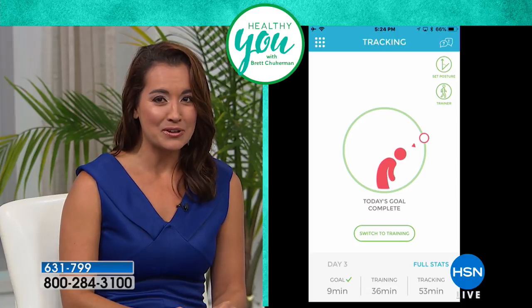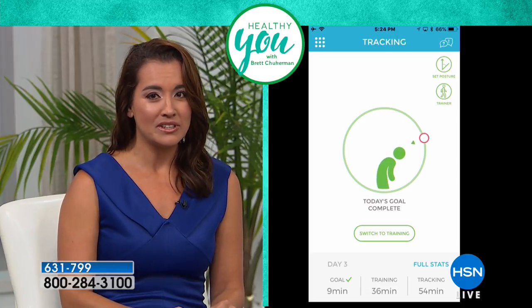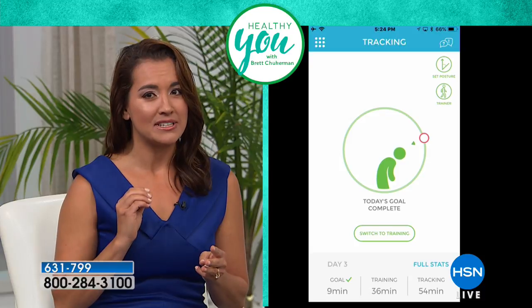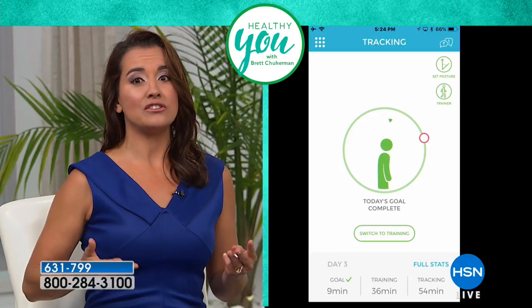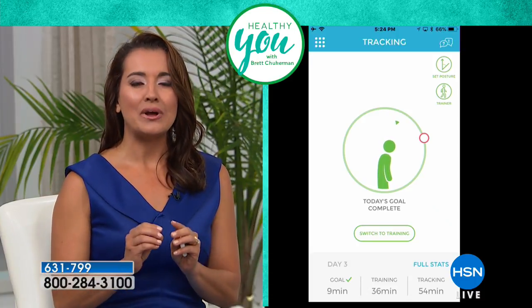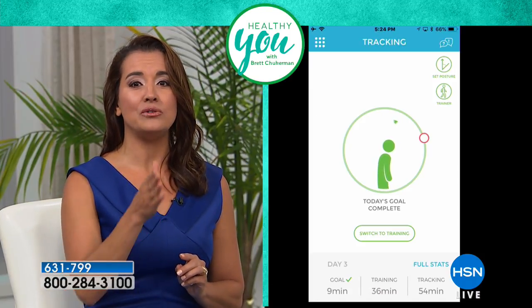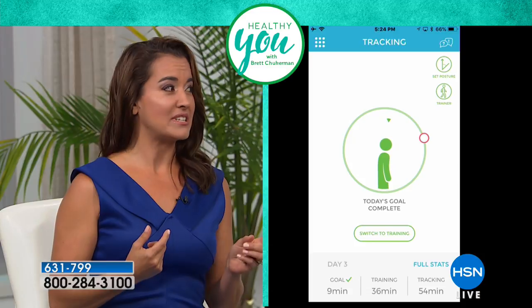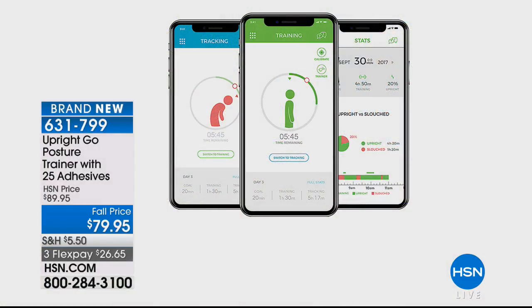It's great because when you're done with your day of training — I always say start off small, do your training mode, mine is set up for nine minutes a day — then put it down and gradually grow. Because if you try to do this eight hours a day, you will get a sore back. Take it slow and you're going to get a progress report at the end of the day showing you how much you're slouching and how much you're sitting upright. The first day I did it I was 53% slouched. It runs on a rechargeable battery — plug it in, it runs for 12 full hours. If you're only using it nine minutes a day, we're talking weeks before you'd have to recharge it. It's a free app, available for Apple or Android.